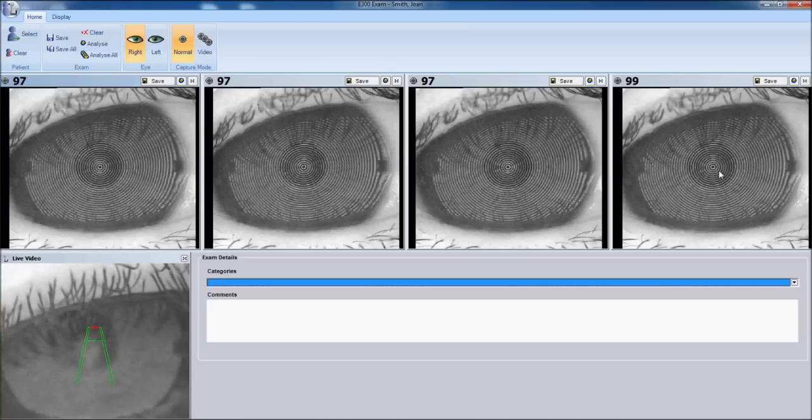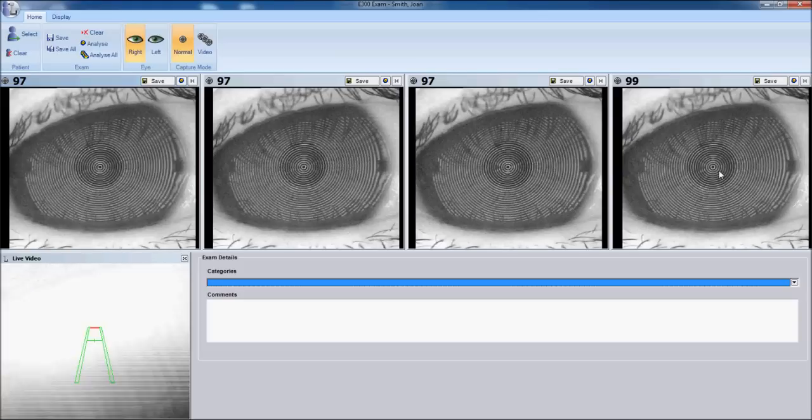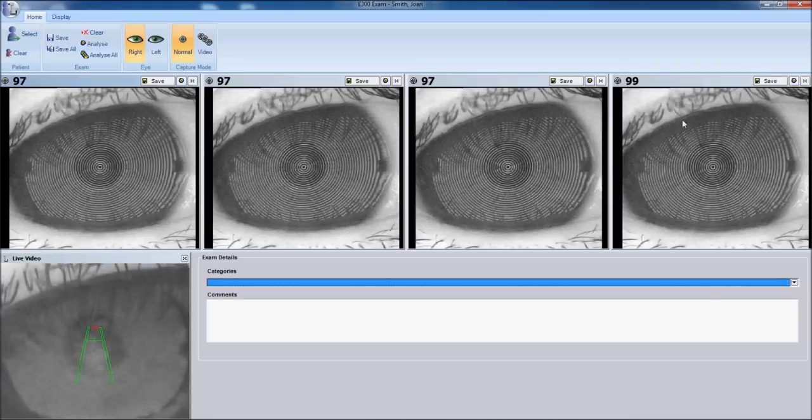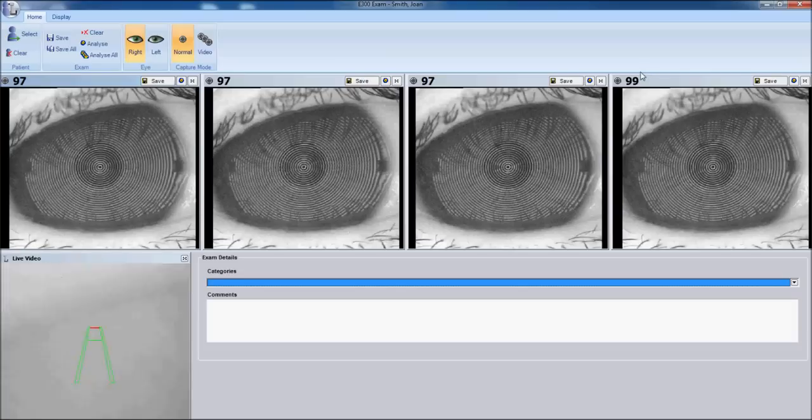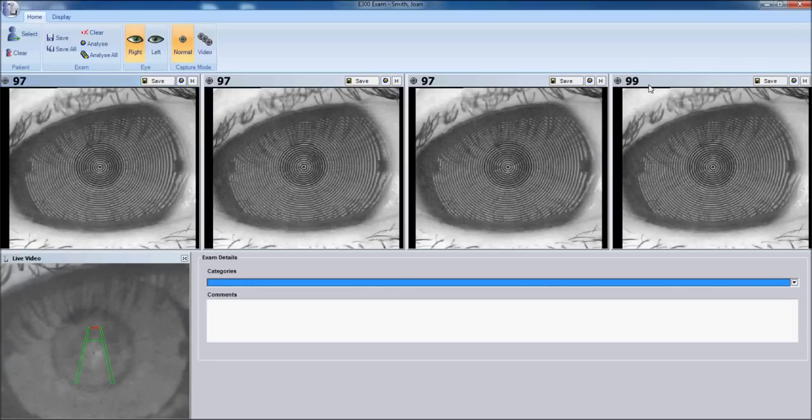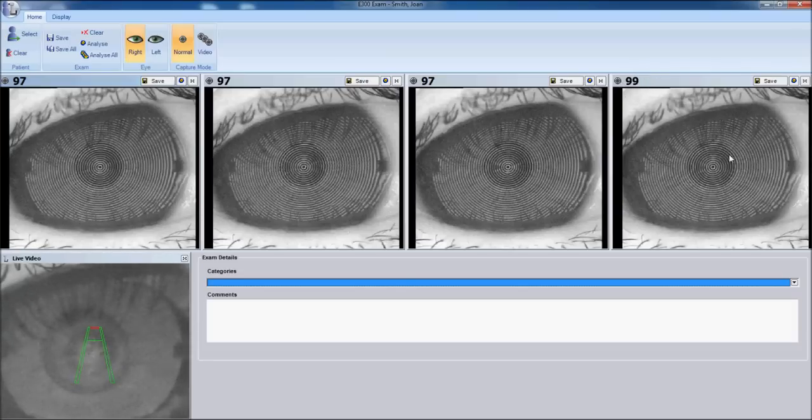You will always have four images captured. The right most will be your best percentage. Anything over 95% is considered accurate or valid by the instrument.